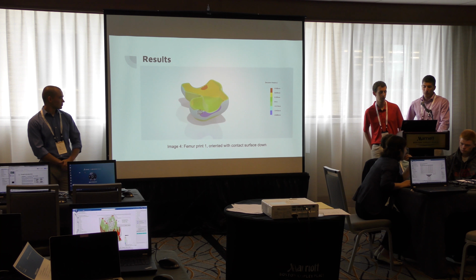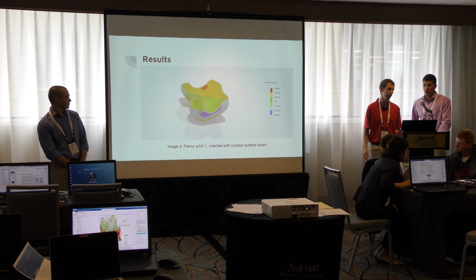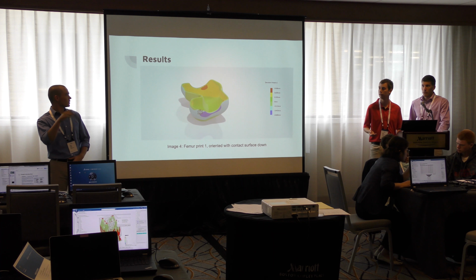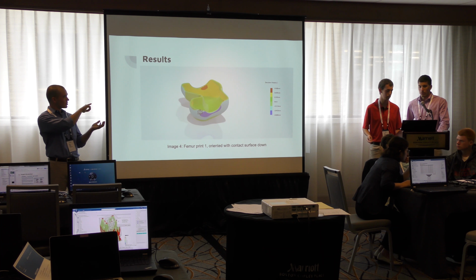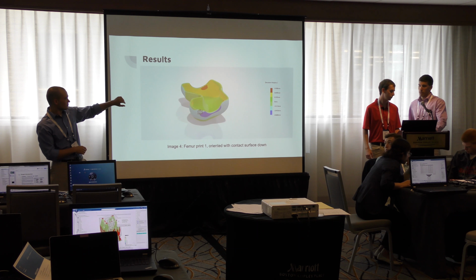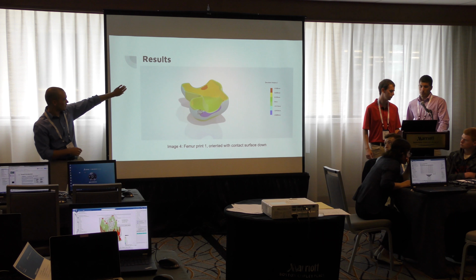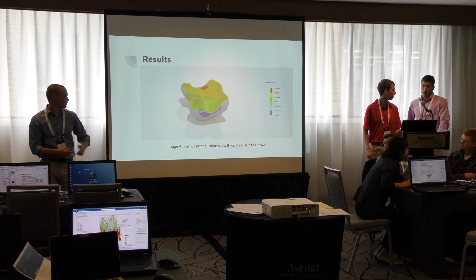And then we also ran a simulation with the contact surface down, for the femur implant. This is the same one, just a visual of the bottom side of it. The deformation is a little bit different on the inside. You can see the max outward deformation is on the inside, as well as on the other side, on the new side.